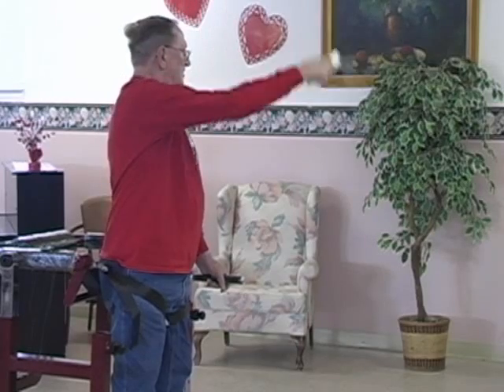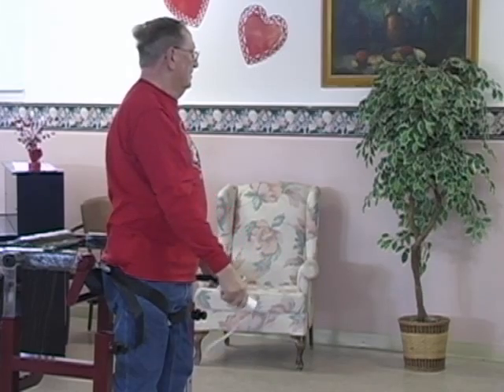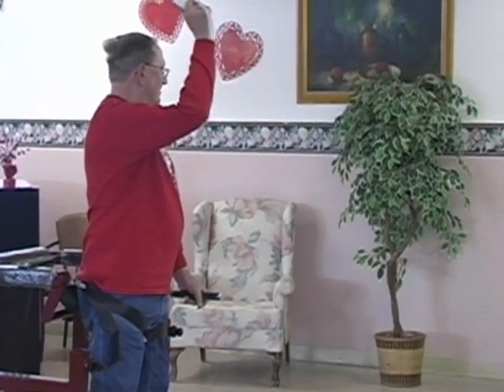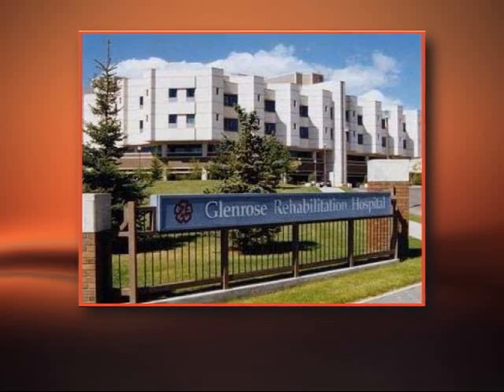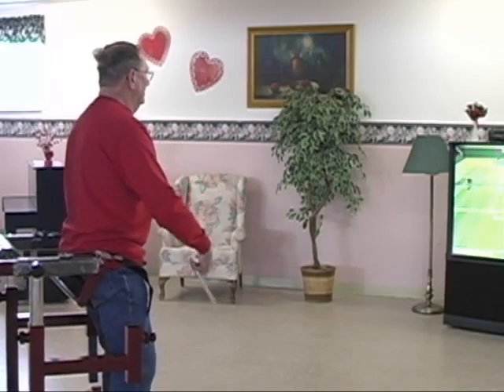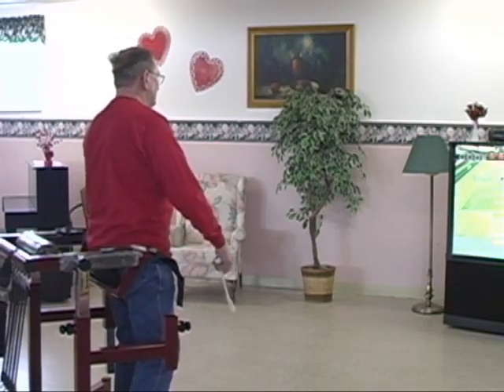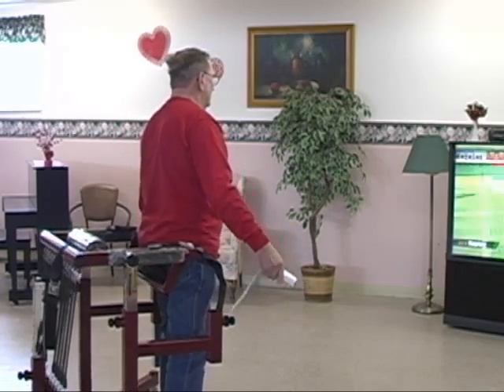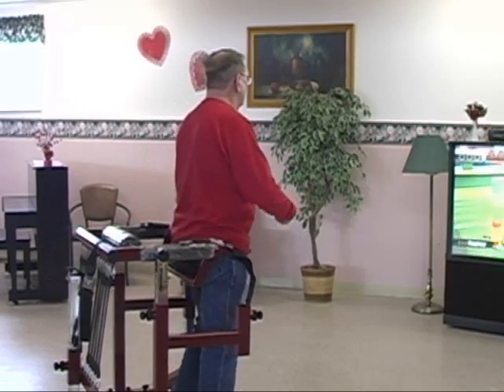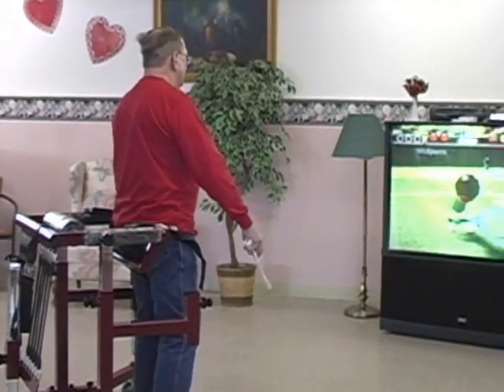Here, the Bungie Mobility Trainer enables the type of desired movement that would otherwise be impossible and unsafe to execute. The Glen Rose Rehabilitation Hospital in Edmonton, Alberta is now using the Wii technology to treat patients with movement and balance issues. They demonstrated how the Wii game is helping a boxer who had substantial brain injury in the ring redevelop his right jab and improve his balance.